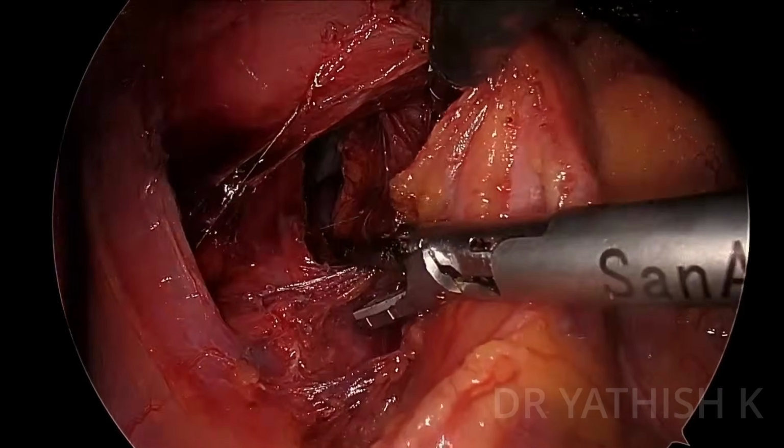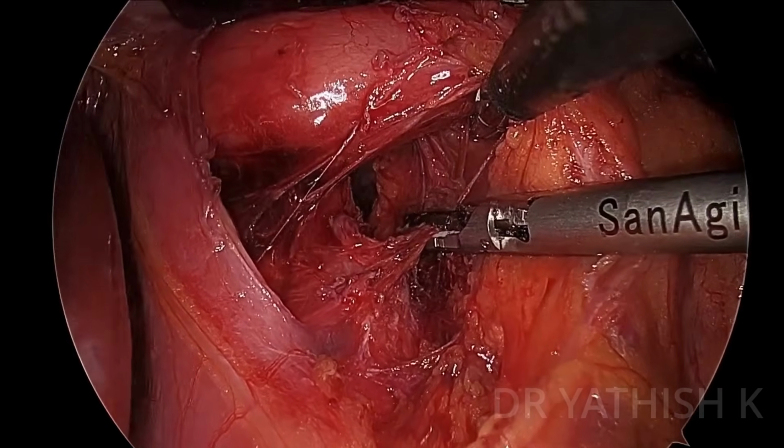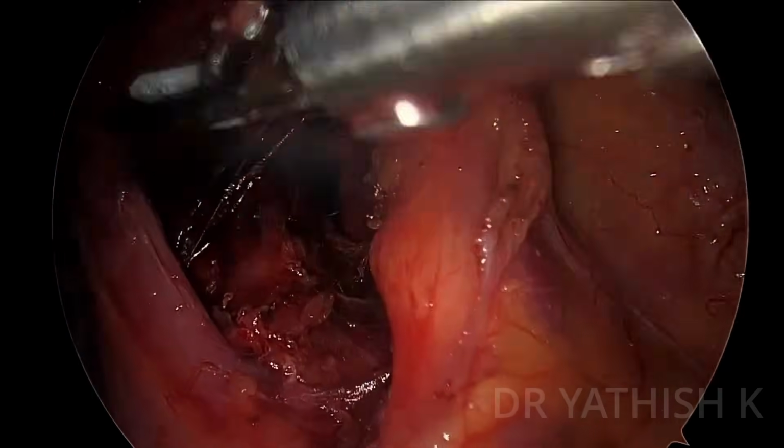So we need a complete fundal mobilization. We don't want any of these posterior attachments, which will pull your wrap and end up in a wrap disruption later on.